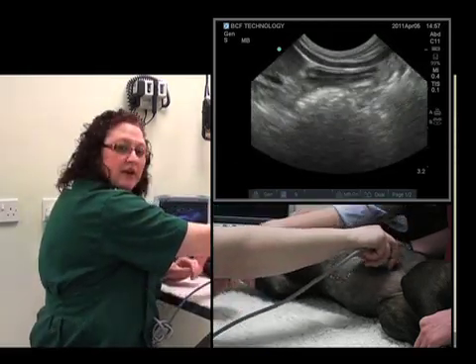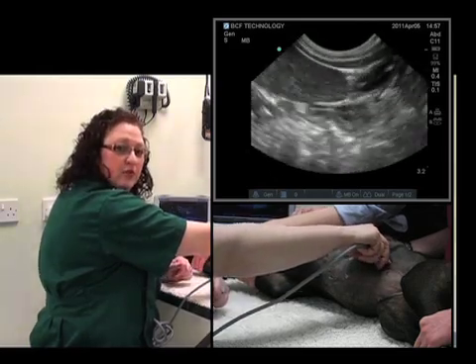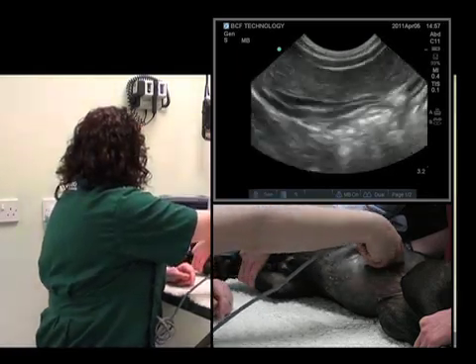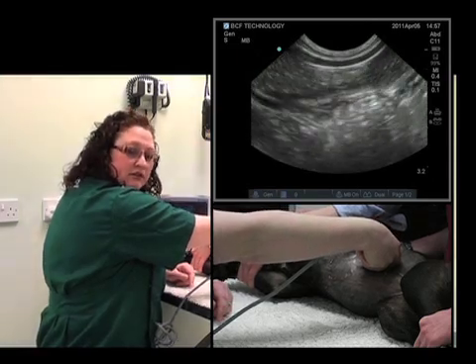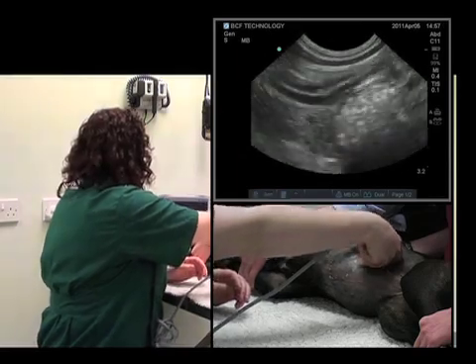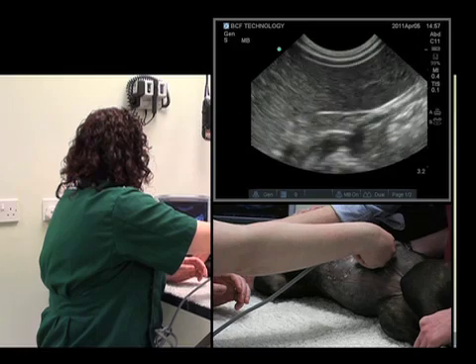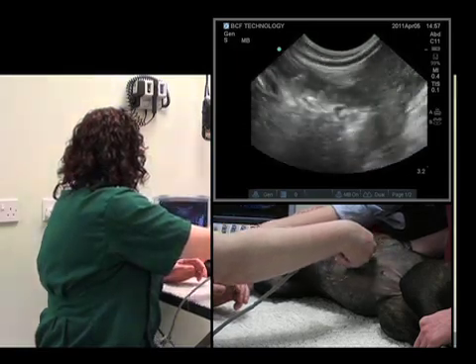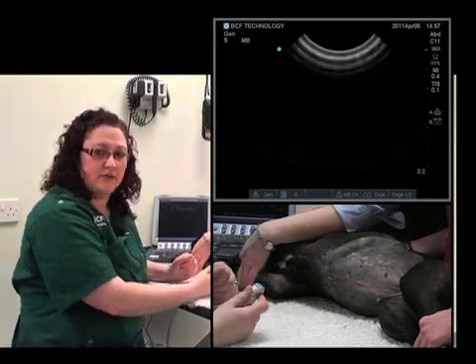Just like a radiograph, we want to see everything in two planes. So we'll now rotate the probe 90 degrees clockwise and slide all along the portion of the spleen in a cranial direction. And we've seen the entirety of the spleen.